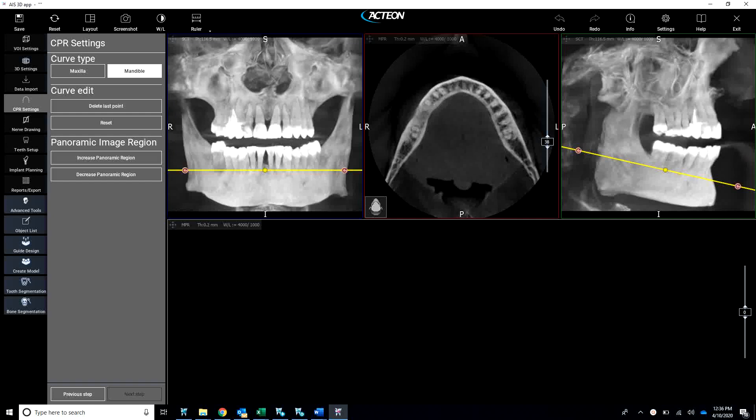Hey everybody, it's Taylor Bowser at Acdion North America. Today I just wanted to walk through a quick little implant planning case and show you how easy our software really is to use.